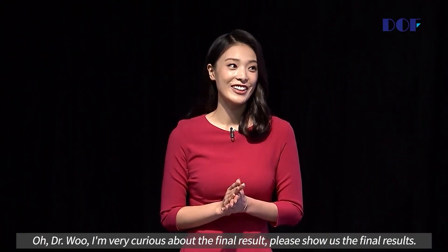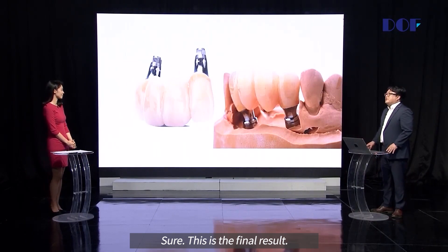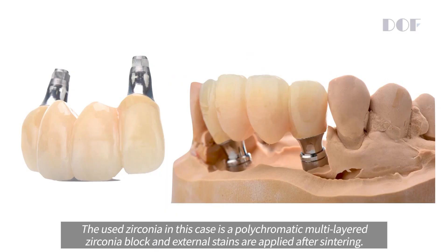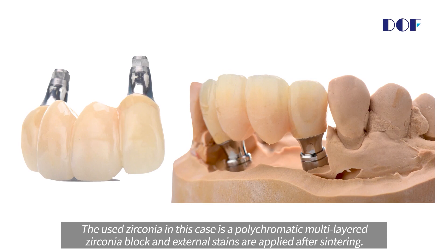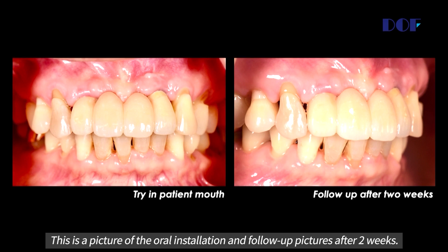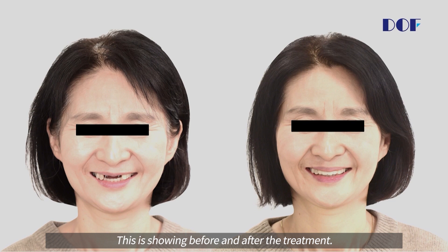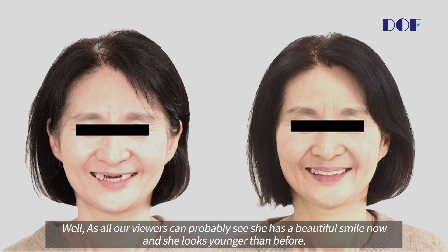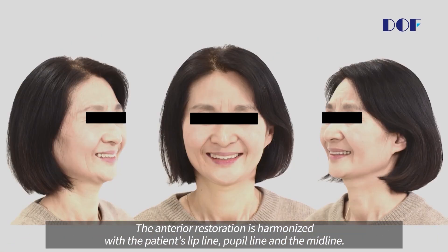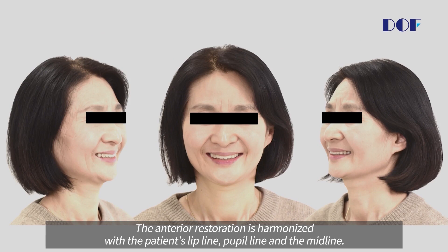Dr. U, I'm very curious about the final result. Please show us the final result. This is the final result. The zirconia used in this case is a polychromatic multi-layered zirconia block. The external stain was applied after sintering. This is a picture of the oral installation and a follow-up picture at about two weeks. This is the before and after the treatment. She has a beautiful smile now and she looks younger than before. The anterior restoration is harmonized with the patient's lip line, pupil line, and midline.